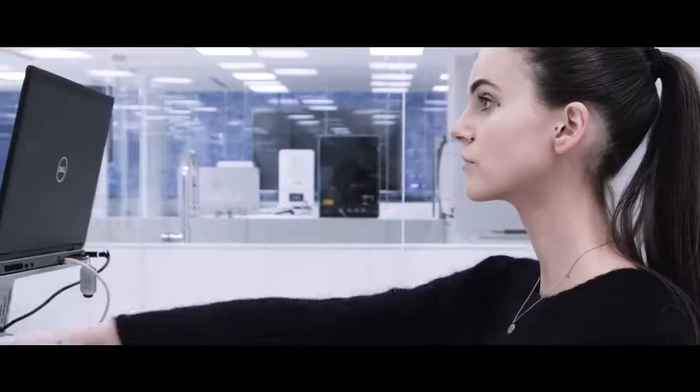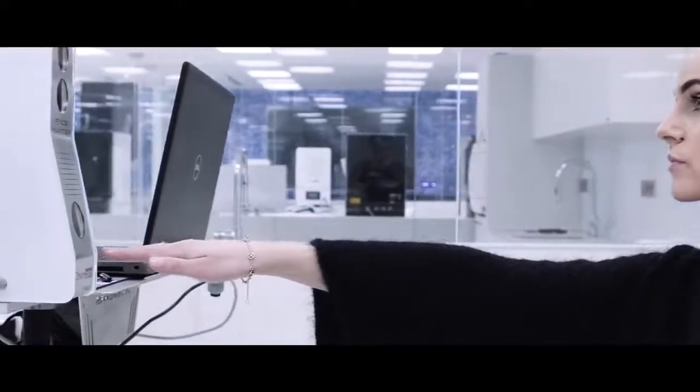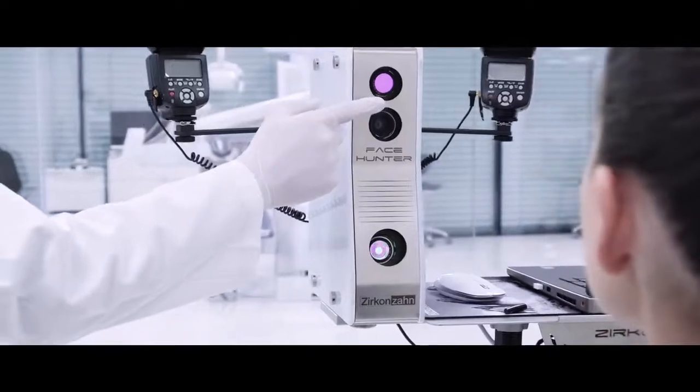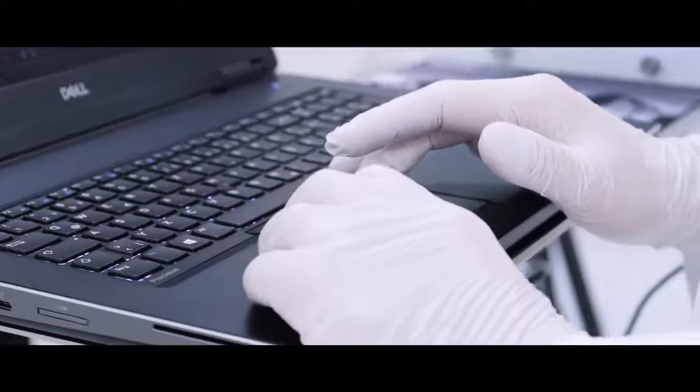The FaceHunter is properly distanced from the patient before starting with complete acquisition of the face in neutral expression. At this stage, a frontal scan, a 45-degree right lateral scan, and a 45-degree left lateral scan are performed.